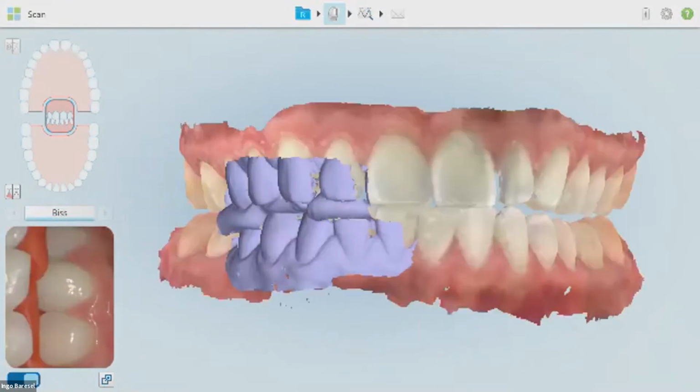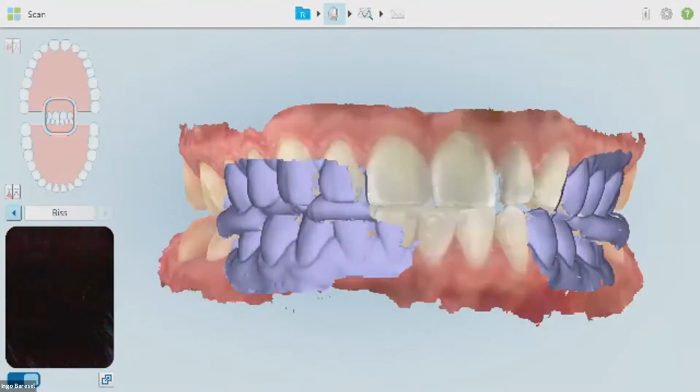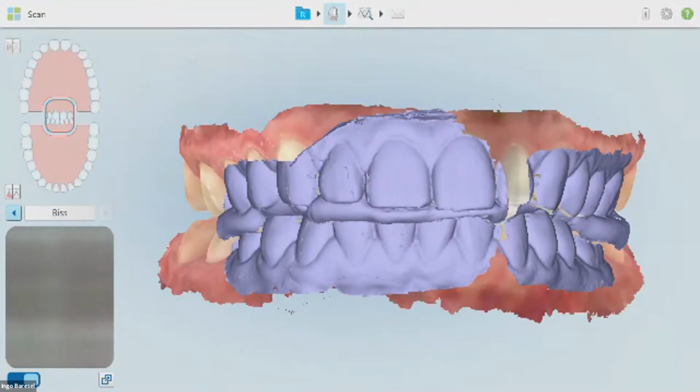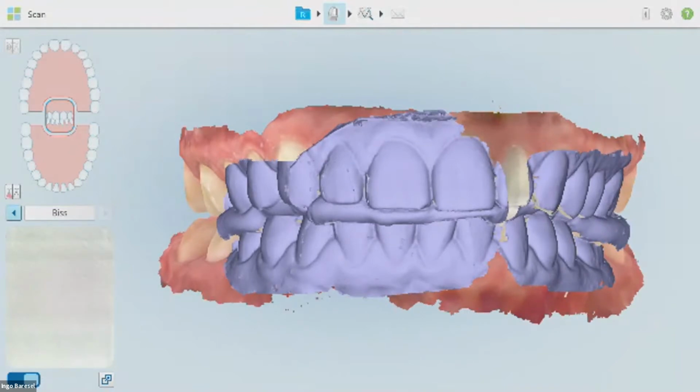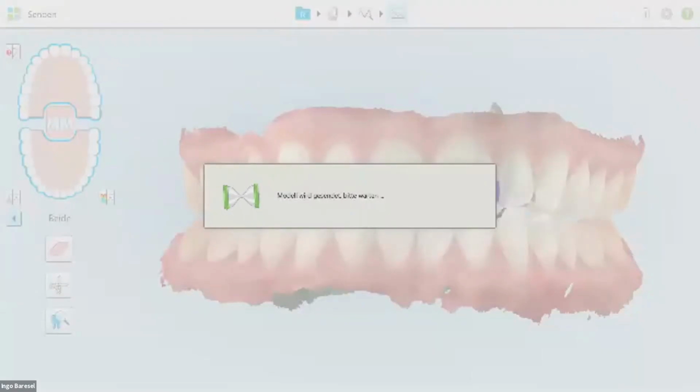On the one side, okay, that's it. On the other side, that's it. And the third one, at the incisors, that's it. So this is done. And you see, these are just a few seconds. So now we will just have all those things calculated. This is just 1 or 2 minutes. No, it's already done. And now I will go back to the scanner, and now you will be able to send this, and we will send the data, and that's it. So really, really, really easy.